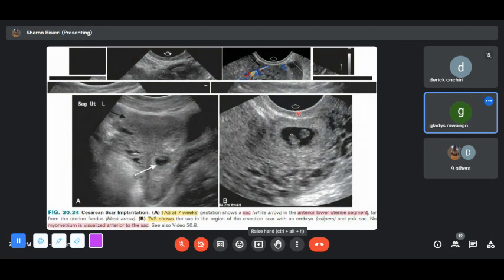Surrounding it are vessels, right? And those vessels tend to develop again in the lower uterine segment, because you tend to have a rich vascular network around the cervix, as now you have the anastomosis going up as arcuate vessels between the intermediate and the external myometrial layers.